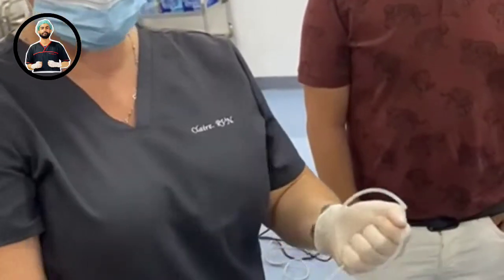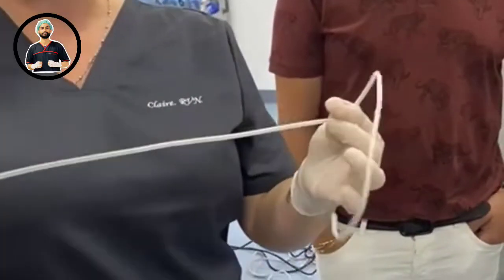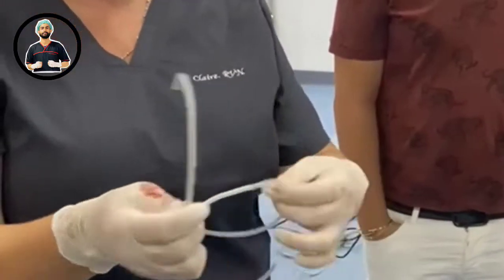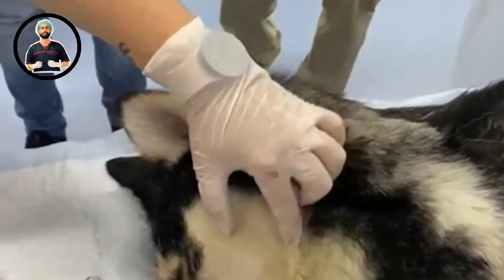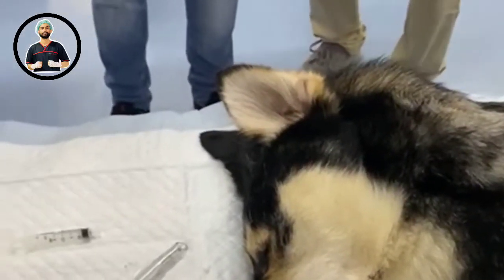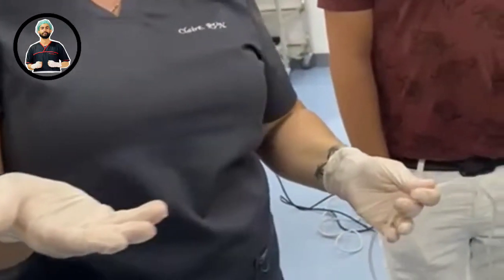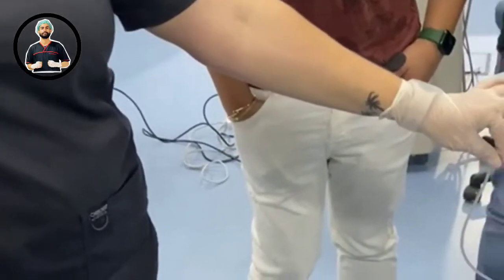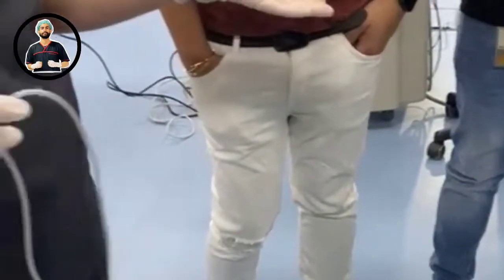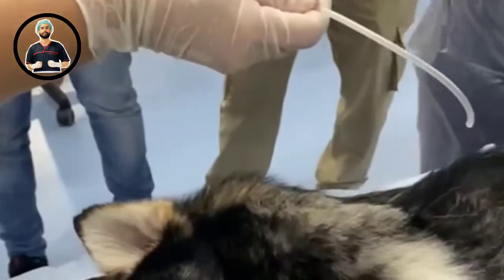We use giving sets as tube ties because they're strong and you can get a good knot around the tube. If you're doing dentals or surgery around the head, you can sterilize these if needed. They also don't absorb water, so it's a little bit drier around the dog's face — no cold bandage wrapped around the nose. It's just a nice trick for dentals, and you can cut up giving sets and put them in the sterilization tray with the ET tubes after they've been cleaned.